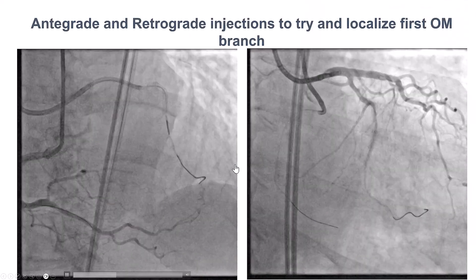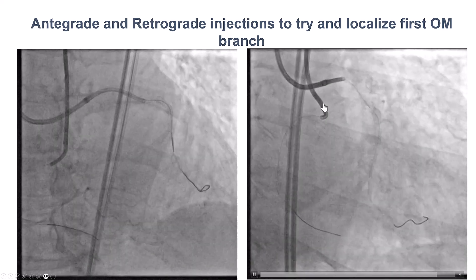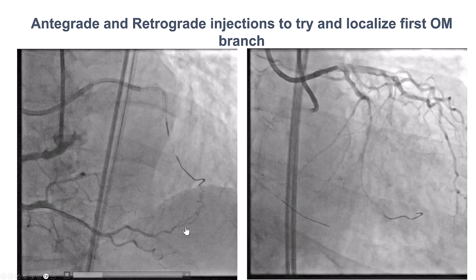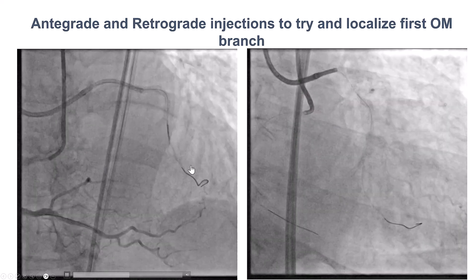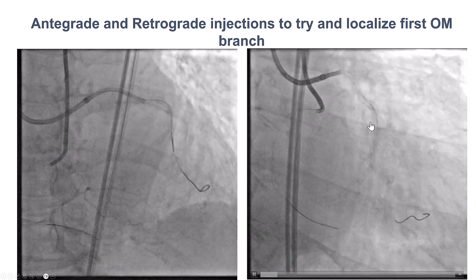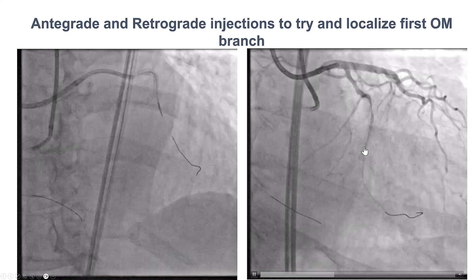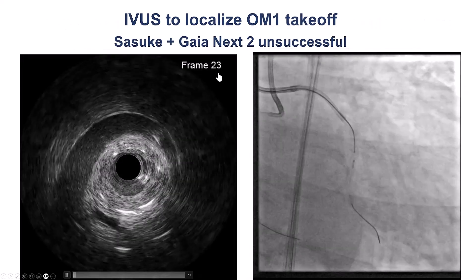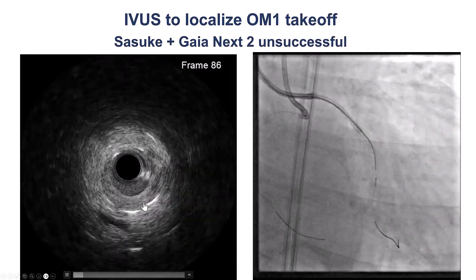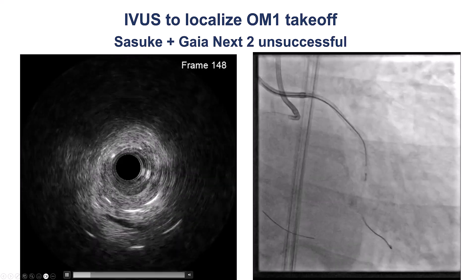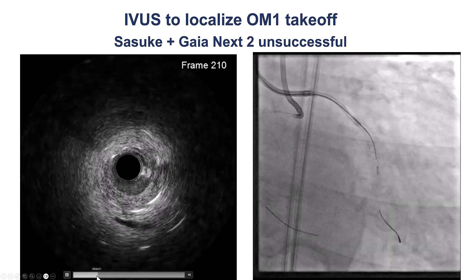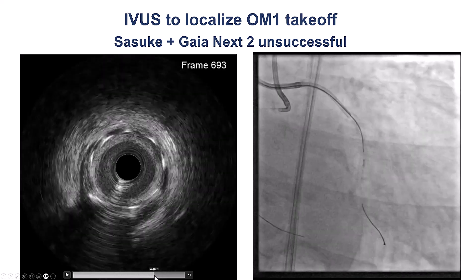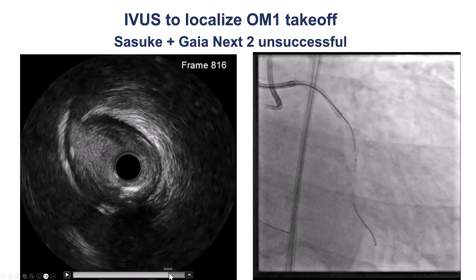The next step was to try to localize the origin of the obtuse marginal. With contralateral injection, we had successfully crossed into the second obtuse marginal, but we wanted to optimize the outflow, especially given that this is a diffusely diseased and small vessel. We used intravascular ultrasound and had difficulty localizing the location of the proximal cap of the obtuse marginal branch, where there was some calcification.